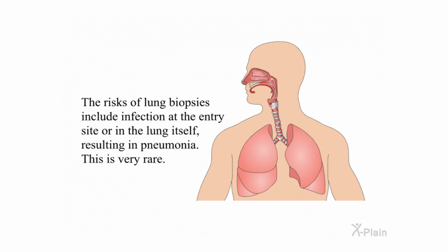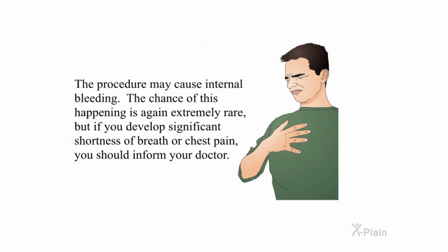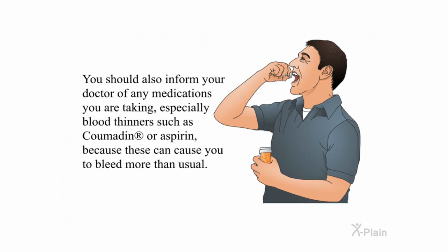The risks of lung biopsies include infection at the entry site or in the lung itself resulting in pneumonia. This is very rare. The procedure may cause internal bleeding. The chance of this happening is again extremely rare, but if you develop significant shortness of breath or chest pain, you should inform your doctor. You should also inform your doctor of any medications you are taking, especially blood thinners such as Coumadin or aspirin, because these can cause you to bleed more than usual.